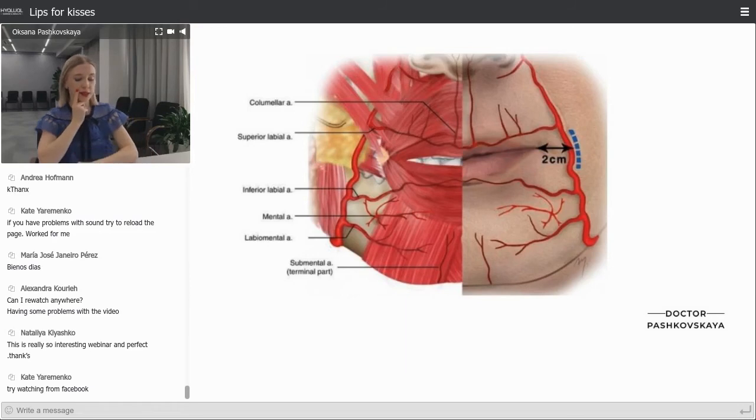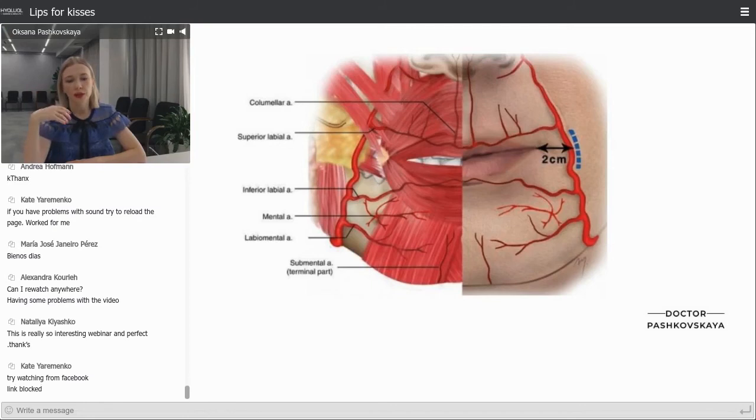The part of the finger below this match corresponds to the most dangerous zone, because in most faces it's the region where the facial artery gives branches and bifurcates. So never work here with a needle, only cannula, and be really careful in this zone.